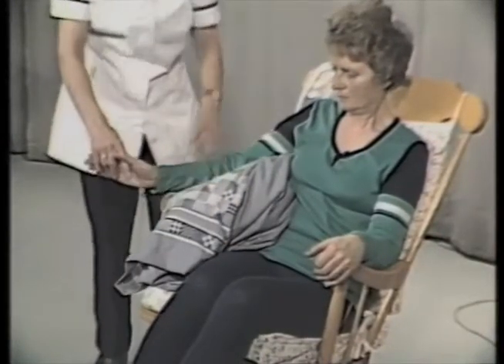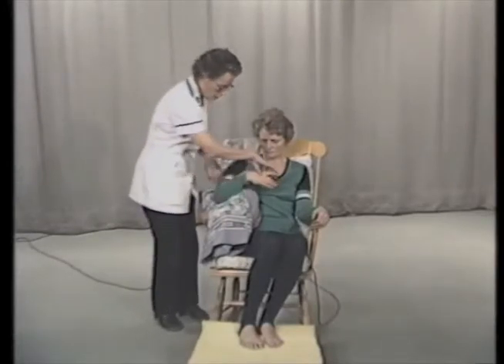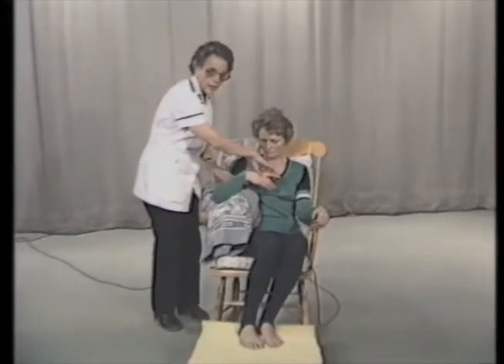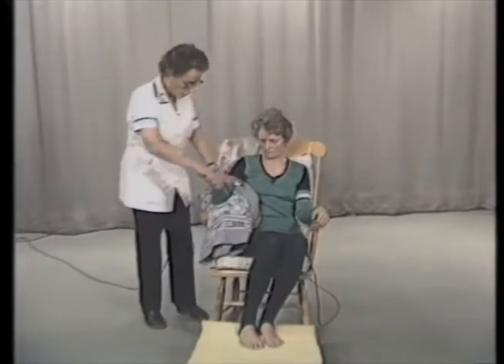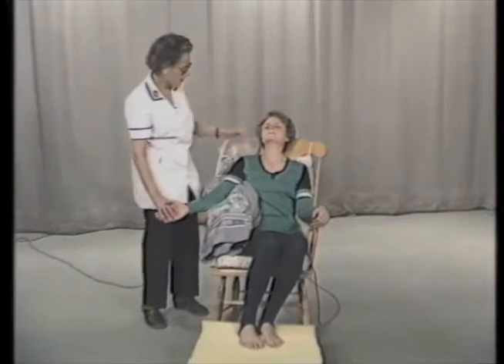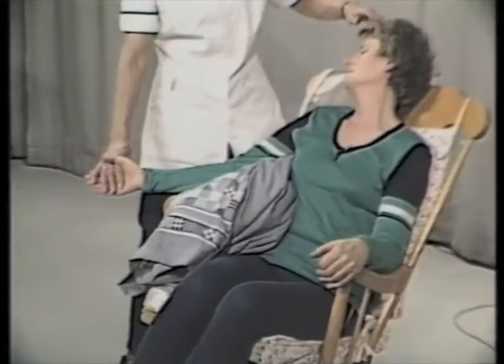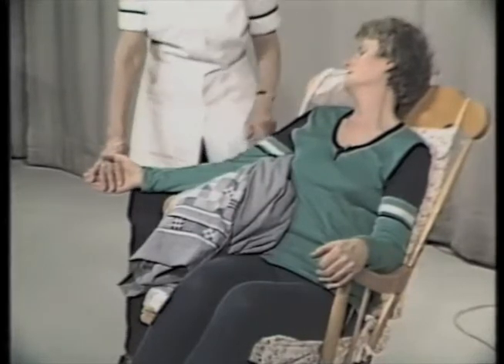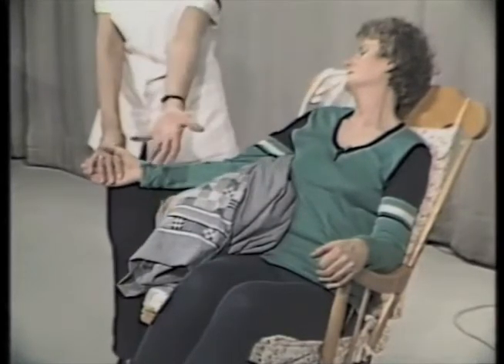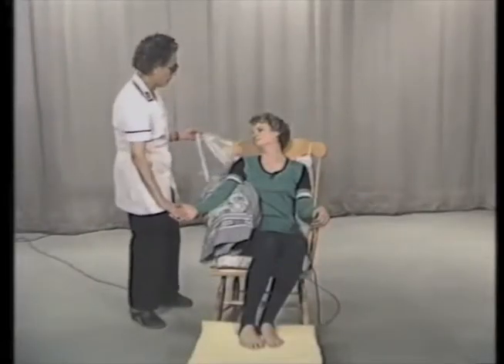And then, because sitting is a total flexion pattern and it would put the arm also into flexion, we try to help the distribution of tone in the forearm by asking them to drop their head back so that the neck goes into extension and to rotate, which brings in the tonic neck influence that really helps give us extension in the forearm. And in this position, we're ready to apply the splint.